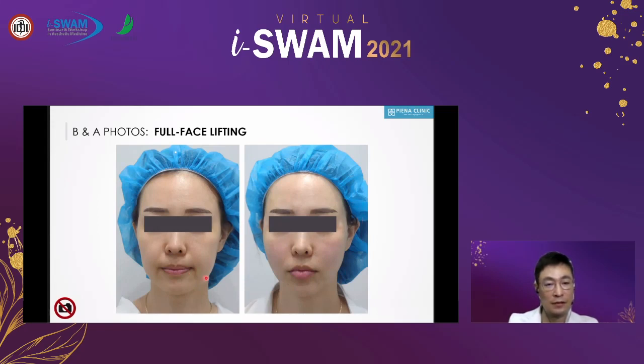I put this in this direction for mid-facial lifting, and also I lifted her eyebrows. After treatment, her facial contour has changed much more nicely, and her eyebrows and upper eyelids are well lifted. Therefore, in some cases, we should consider additional lifting for the mid-face and lower face to achieve a better brow lifting effect.